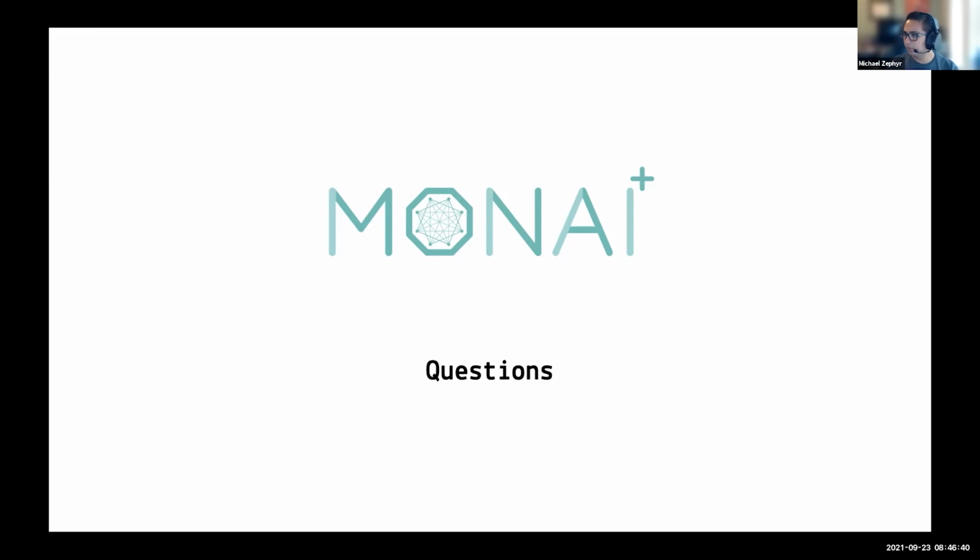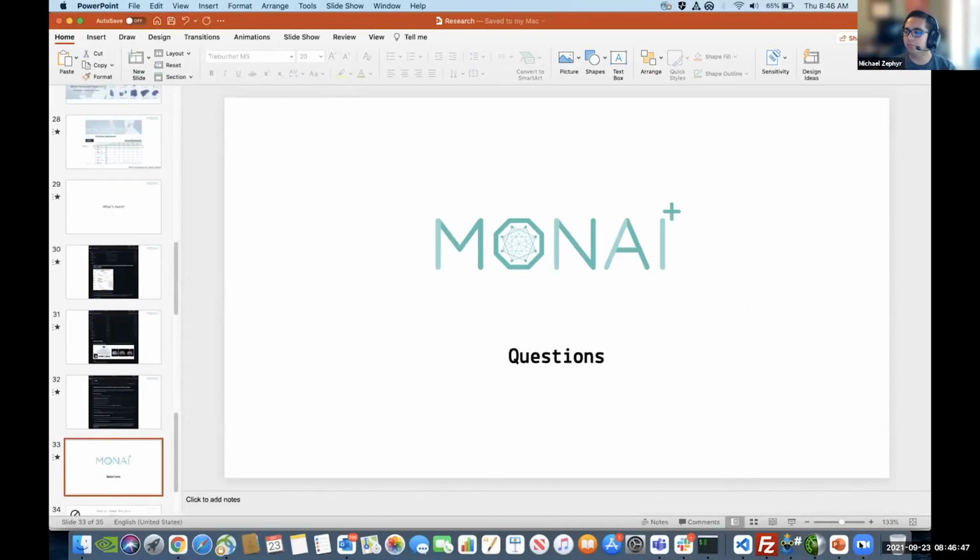Okay, great. So there's two more here. Someone asked, was CE loss attempted for the 3D spleen segmentation runs in addition to dice and dice CE loss? Sorry, can you repeat the question? Was CE loss attempted for the 3D spleen segmentation runs in addition to dice and dice CE losses? So they're asking about the loss functions that were tested for the 3D spleen segmentation run, and was anything else tested aside from dice and dice CE?